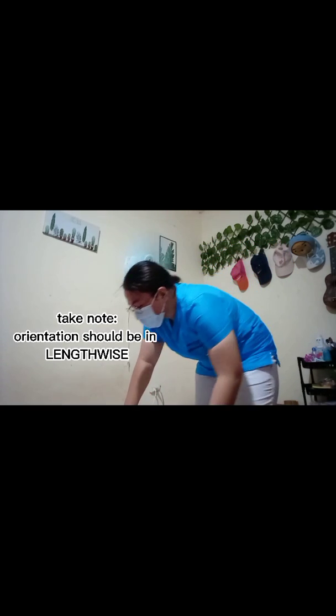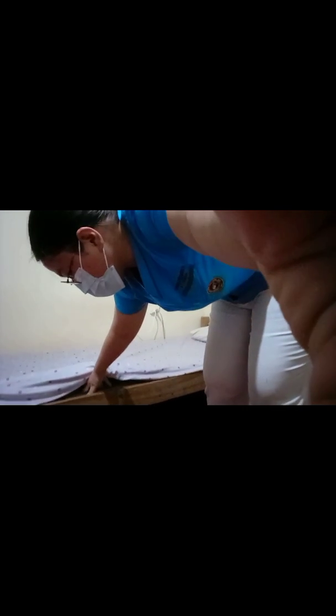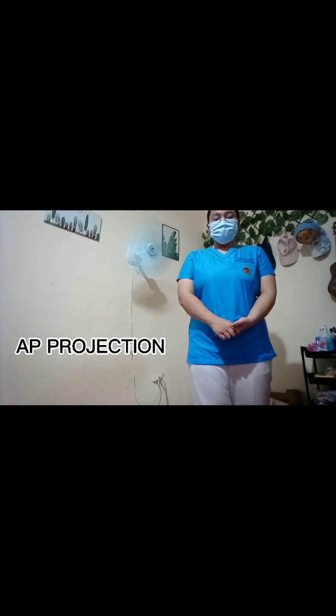Sige. Thank you. So, for our procedure this afternoon, we are going to conduct an AP projection of the femur. For the femur, we are going to use 14 by 17 inches of IR size, which will be put in the table, nakaset. So, it will be located here, assuming that this is a radiographic table. So, the first procedure will be AP projection of the femur.